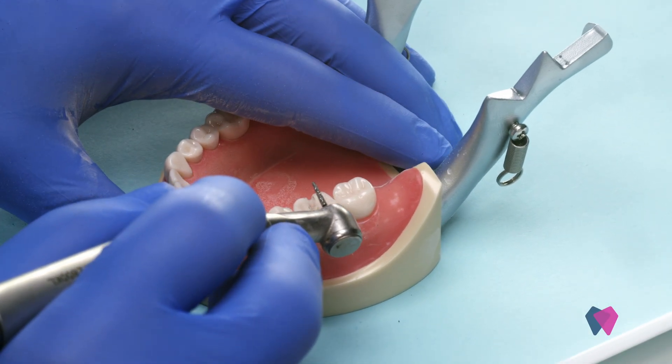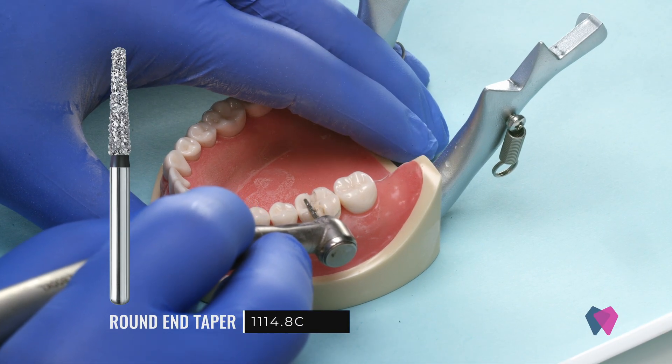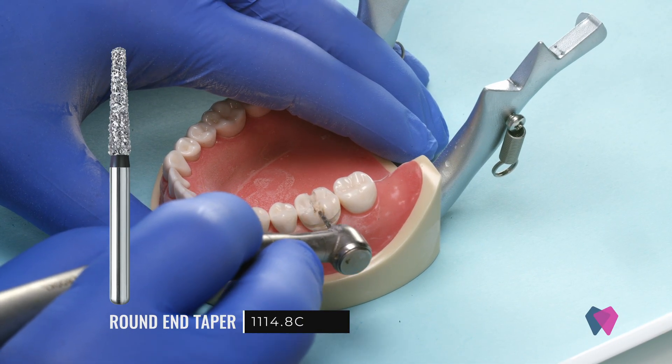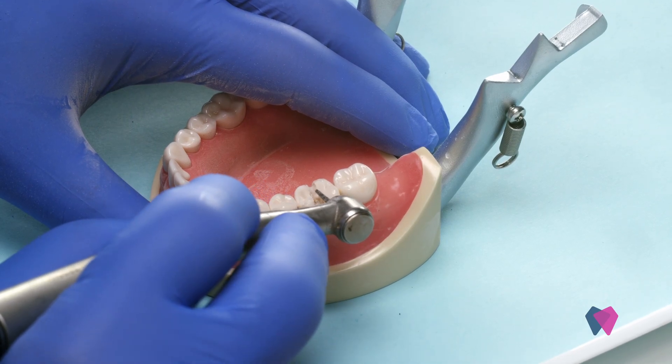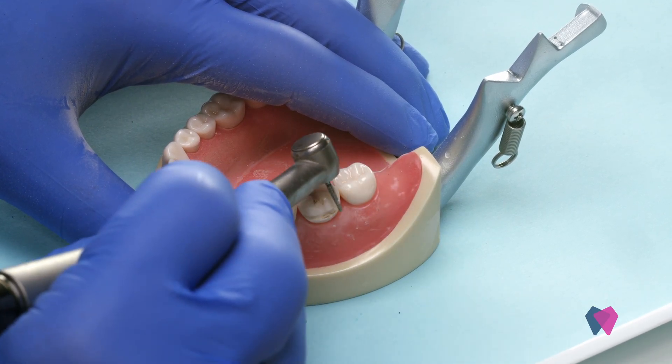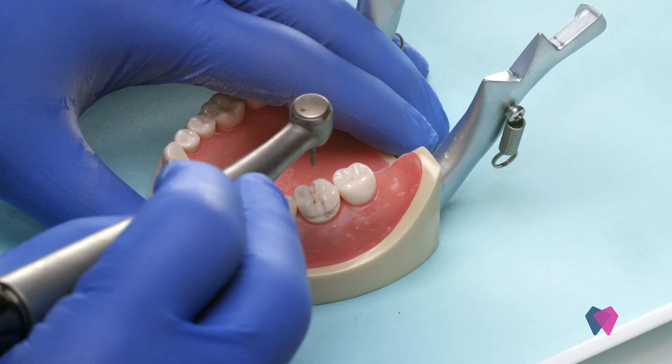We're now going to take the bulk reduction diamond and we're going to remove everything within that depth cut. We always start with the occlusal surface first. That way, when you move to the sides, you've got less cutting to do from the occlusal.